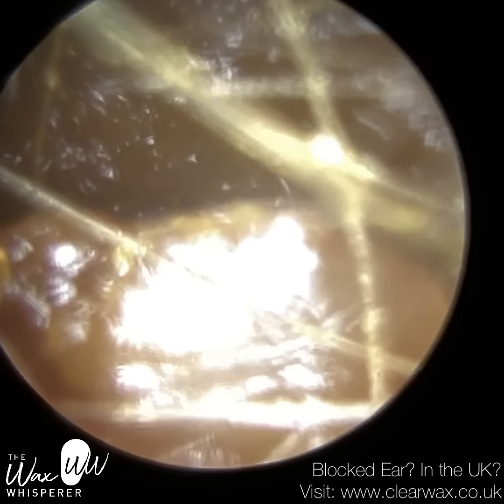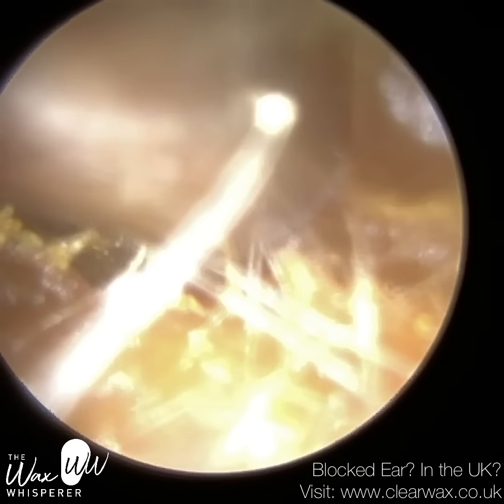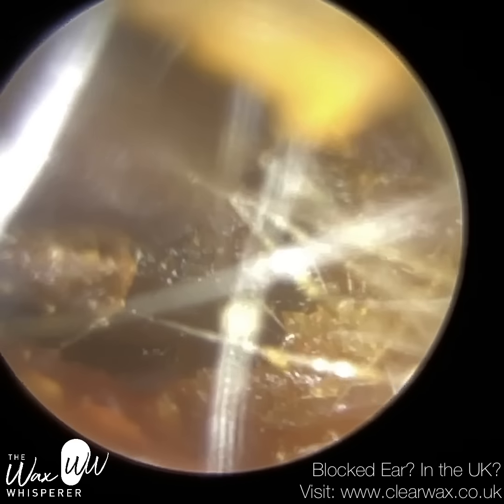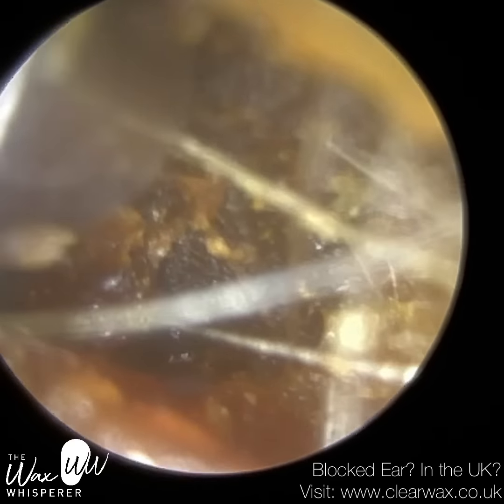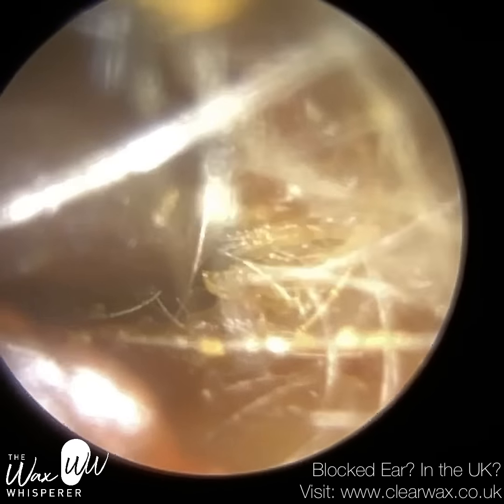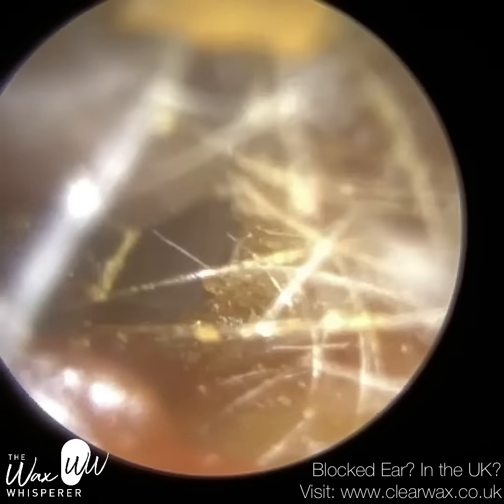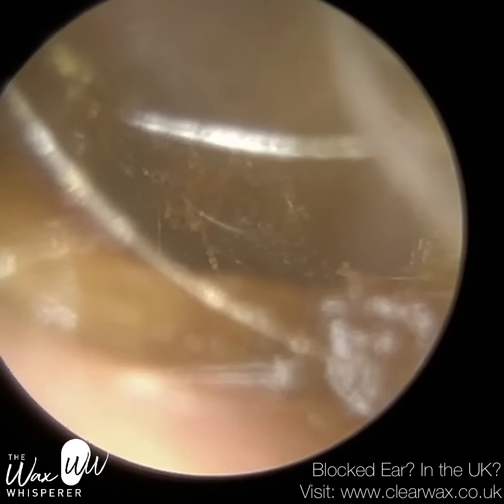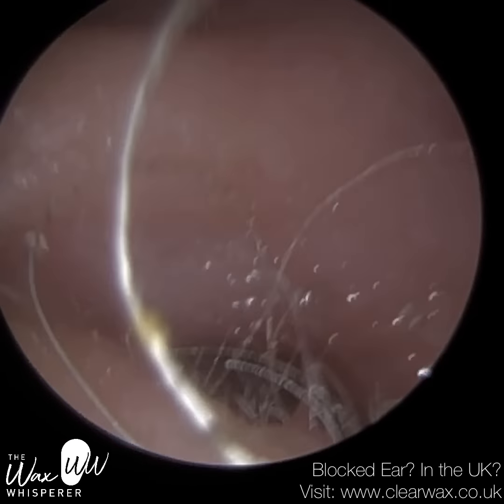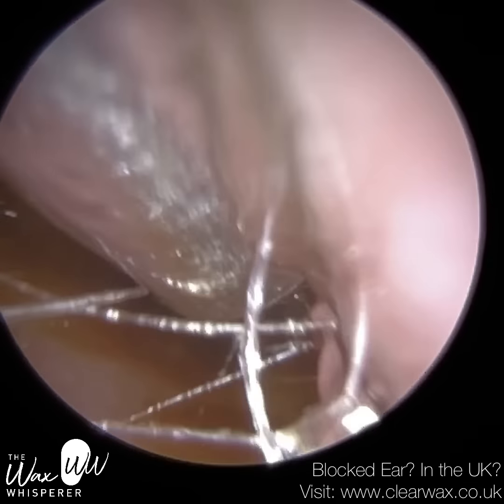Now for the left ear — similarly, the entrance is collapsed. The wax laterally near the entrance is very soft and sticky, and there are loads of hairs in the way as well. I'm performing microsuction once more. Fortunately, this wasn't as difficult as their right ear; it's always the right ear that's more challenging, with softer, mushier wax and a narrower canal. I'm just trying to release some of this wax from the floor of the ear canal and detach it from the side walls. I've just put some drops in to soften the plug and get more purchase to perform microsuction.